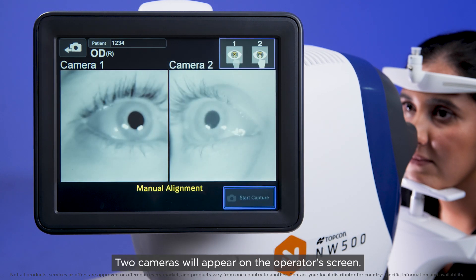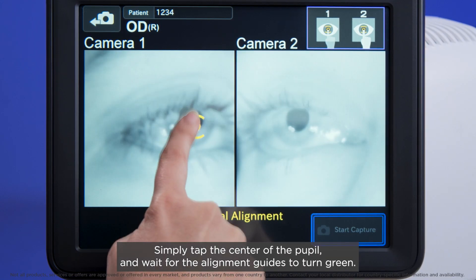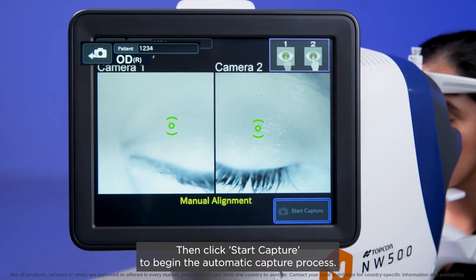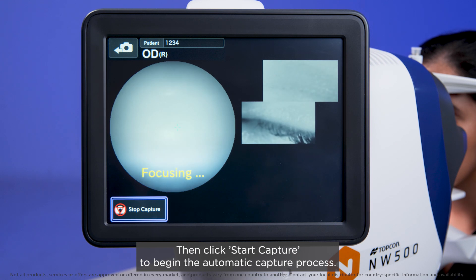Two cameras will appear on the operator screen. Simply tap the centre of the pupil and wait for the alignment guides to turn green. Then click Start Capture to begin the automatic capture process.